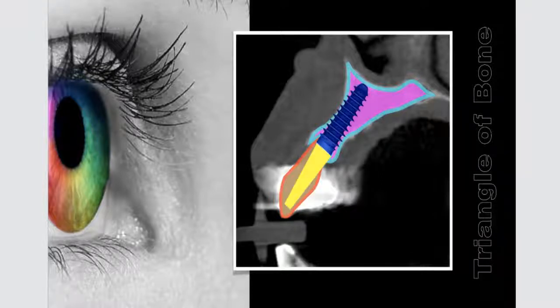And so we have to have a plan of where this implant is going to be placed based upon the type of restoration that we're going to replace it with that's going to be supported by an implant. So in this case, if we wanted to do a cement retained restoration, we can see that yellow projection is going to give us an angle through the envelope of the tooth, and then we have to determine whether or not we have to bone graft to give us the volume, not only to stabilize the implant, but to support the soft tissue as well.